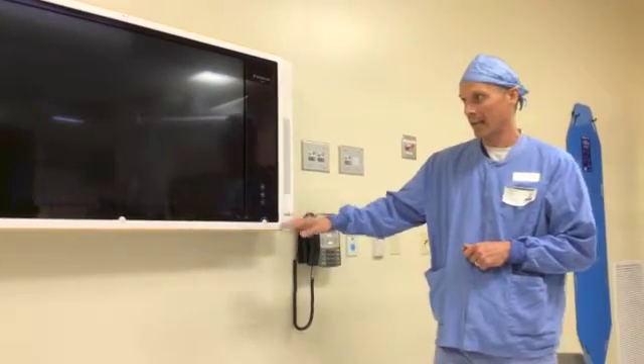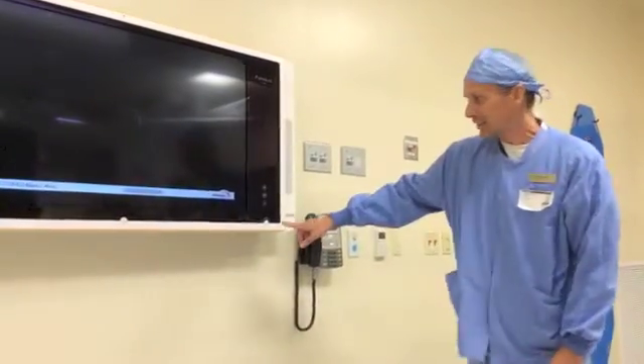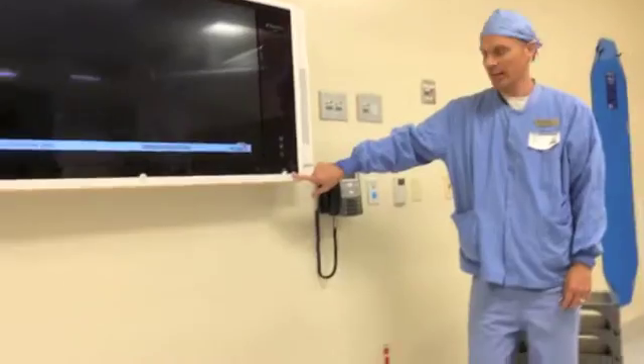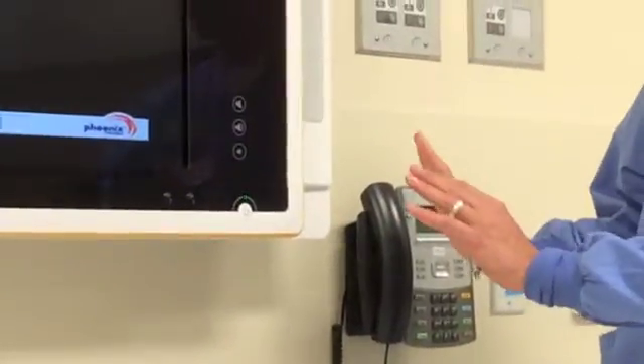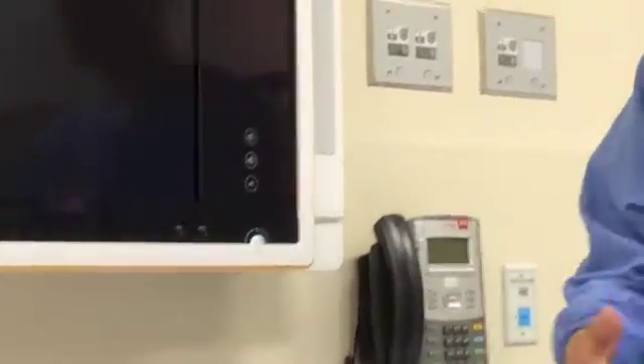If you push it once, it's going to engage that process, and you may see the blue button. You can see here comes the flashes — the flashes are engaging the startup process. My suggestion would be once you push the button once, just walk away from the system and let it begin the boot-up process.